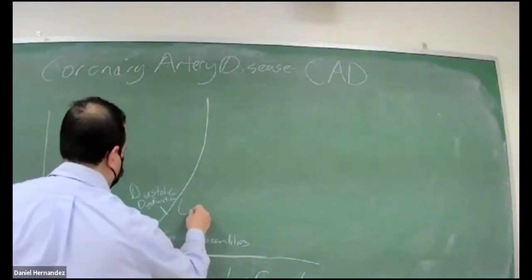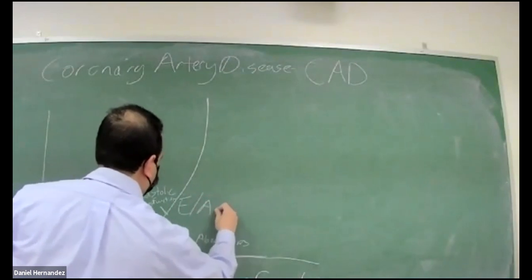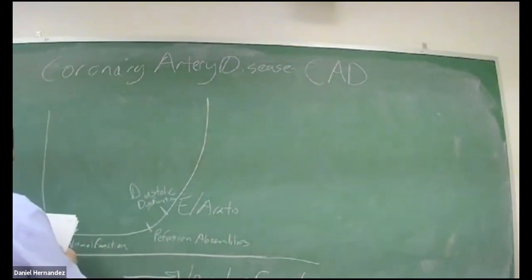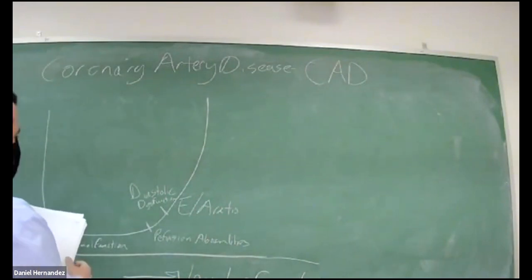So that's going to be our E to A ratio, and E prime, A prime.